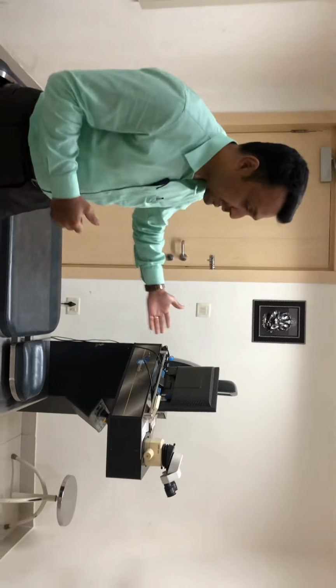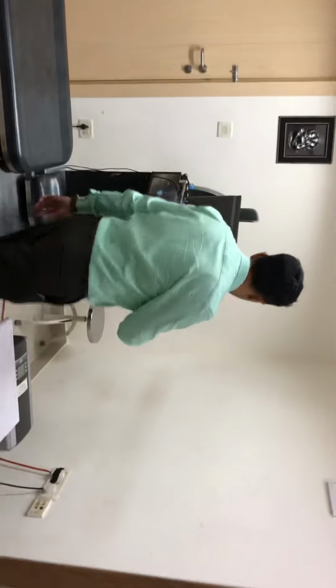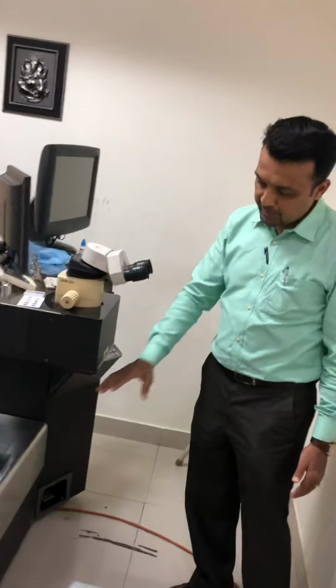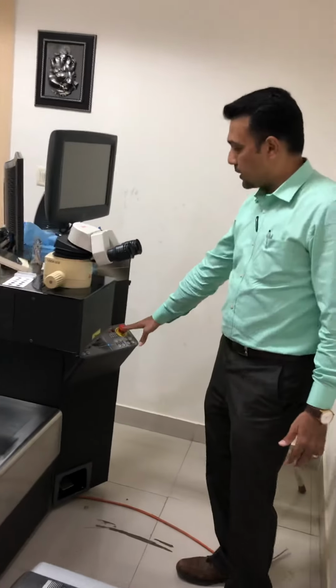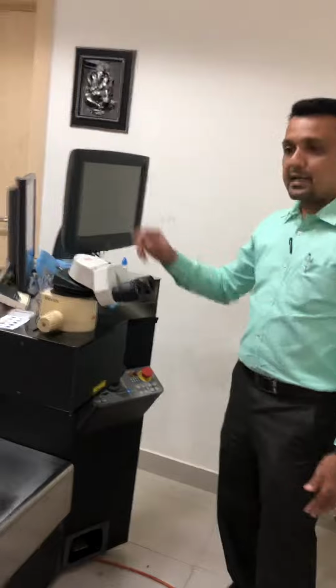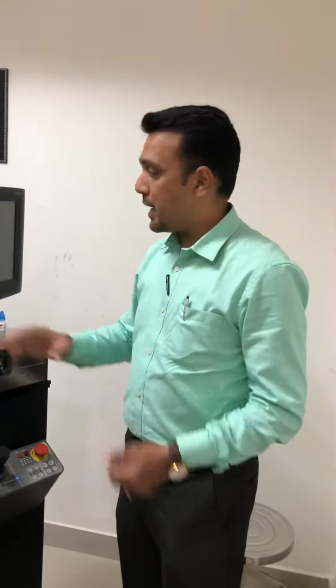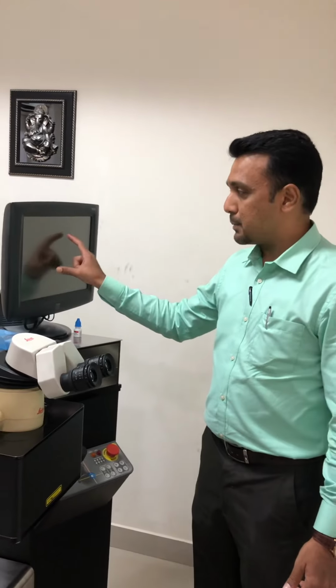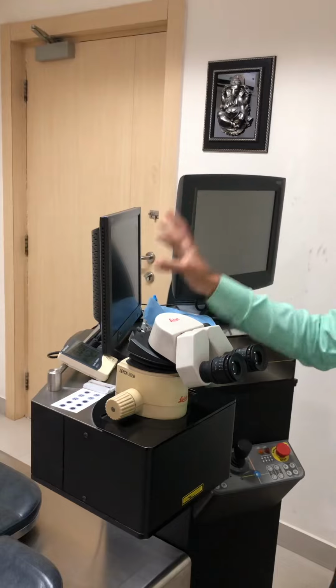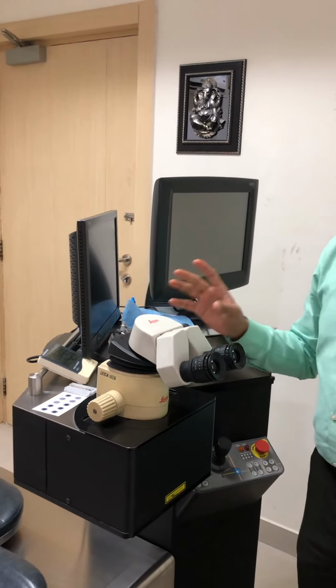Now this machine has got the basic part, which is the main unit, which is called the console. This is the microscope through which we see the patient's eyes. This is the main console, and these are the two computers which have all the parameters entered. For example, if a patient has a power of -4, we enter the power in this particular computer, while this computer is used to select the area where we are going to treat on the cornea. The cornea is the black part of your eyes.